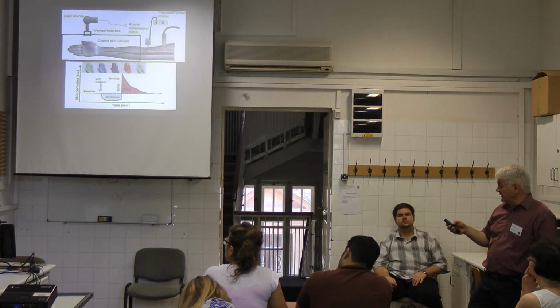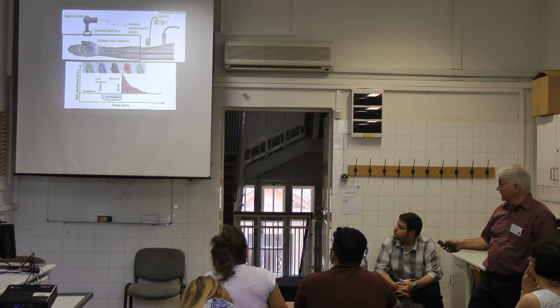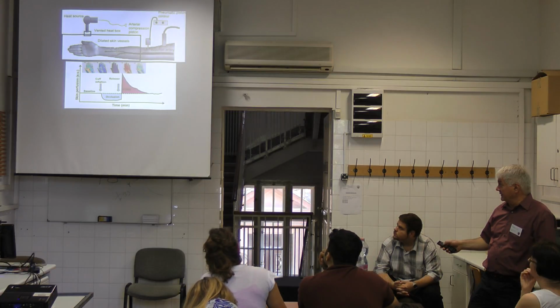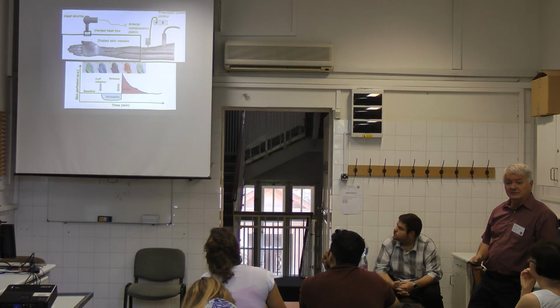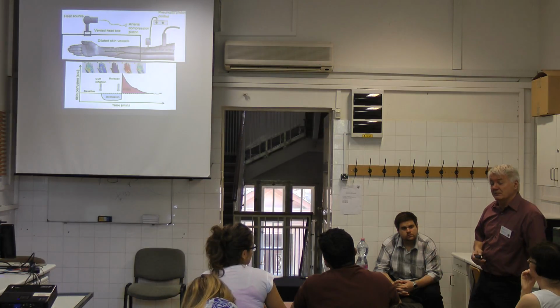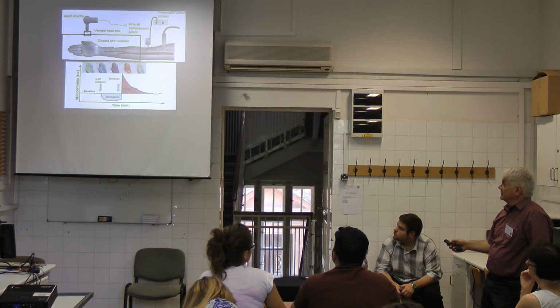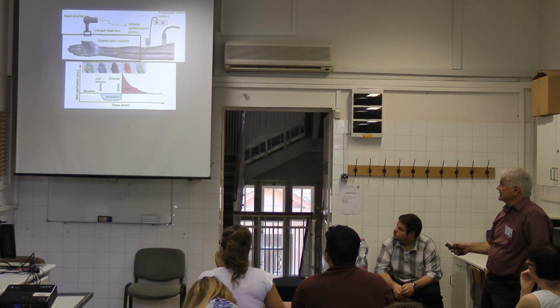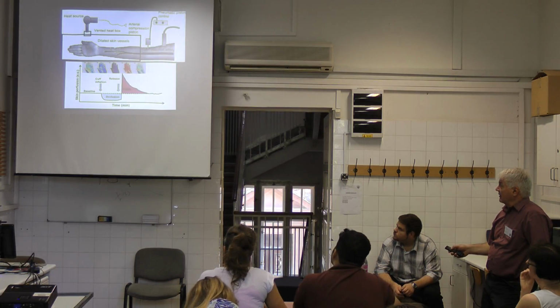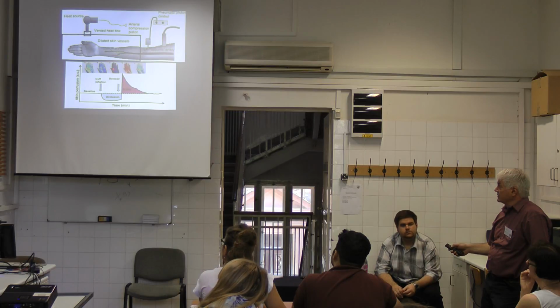So this is a scanning laser image of the hand, and this is the normal microcirculatory pattern. Of course, it is color coded. You know, what does it mean? Color coding always helps to give a better image. Where there is red, there is intense flow; blue and green are less intense. And this is the cuff. When we inflate the cuff, there is an occlusion, and there is almost no blood flow.